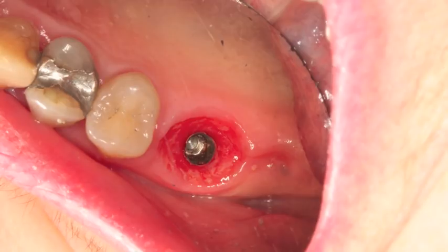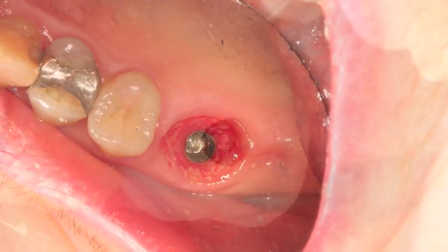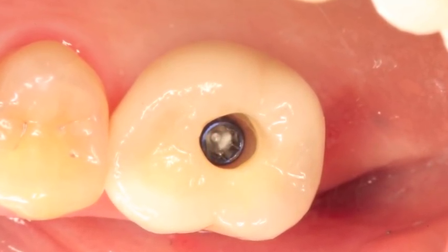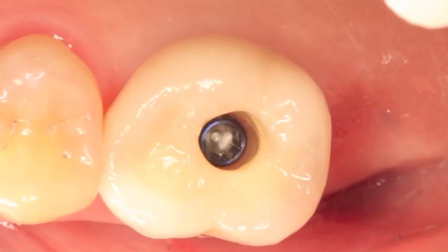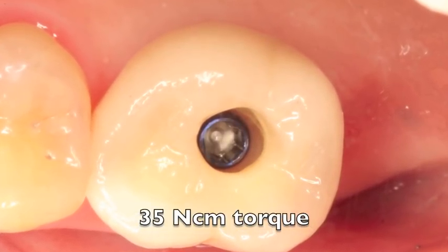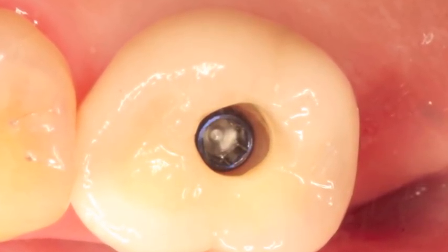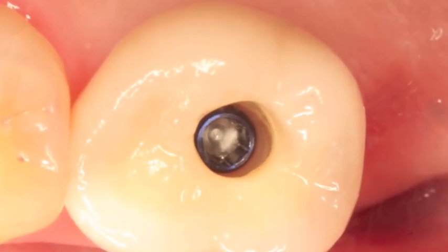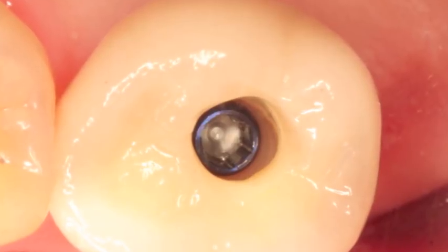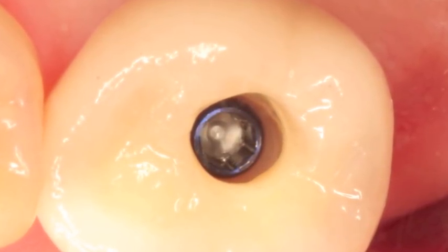Taking the abutment off, we can take the crown to the mouth. We'll put the crown in and hand tighten it to about 10 Ncm. Take an x-ray to make sure that it's seated, then tighten it down to 35 Ncm torque. Here you can see the blue screw — this is the special screw. It's labeled and you can look inside and see that it's blue, which enables you to realize that you're using an OmniGrip driver instead of a UniGrip driver. This is important to write in your chart as well.